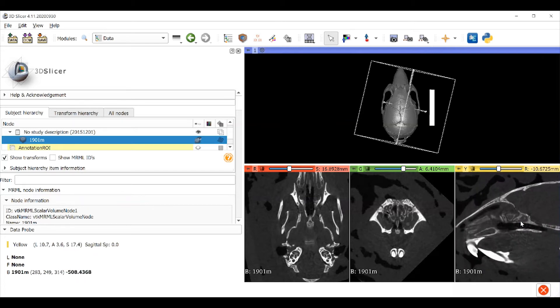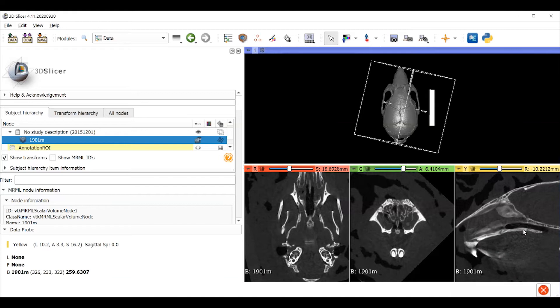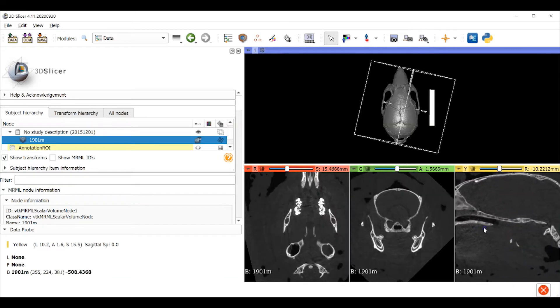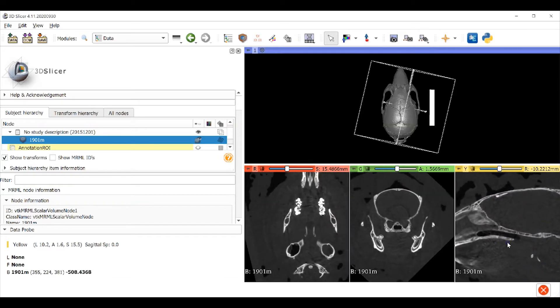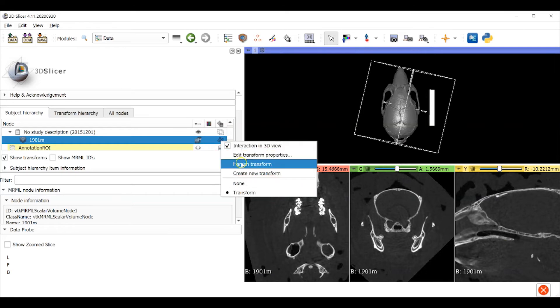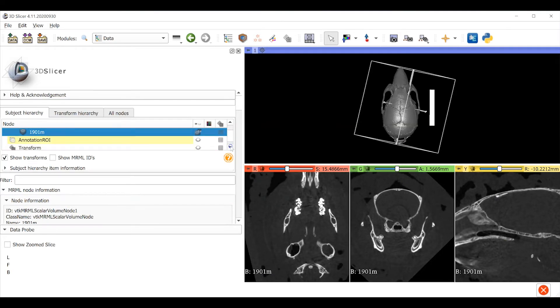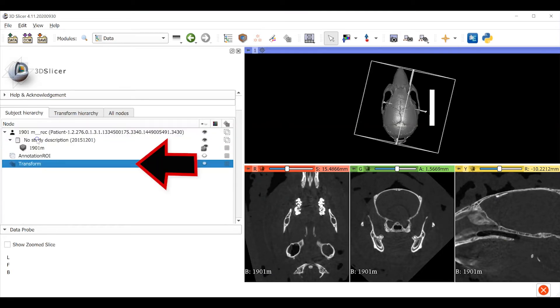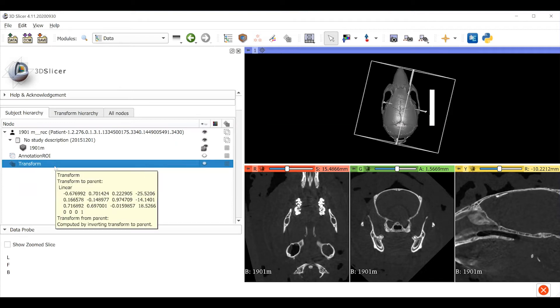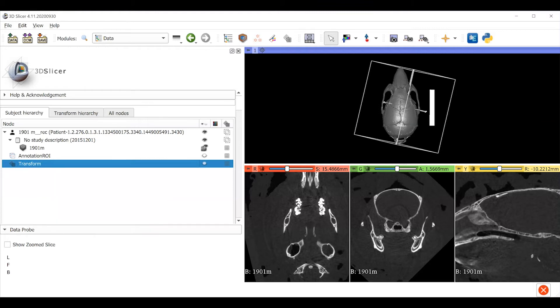When you're 100% satisfied with your transformation, you have to take an additional step to apply the transformation to the data. Right click on the grid icon and select Harden Transform. Your transformation is represented as a transform object in the data module. It's actually just a matrix of numbers that includes information about the translation and rotation of the model. You'll need to be sure that you save the transform object separately for each specimen so that we can replicate your work. This image volume is now ready for landmark collection using the markups module. And don't forget to save your data.